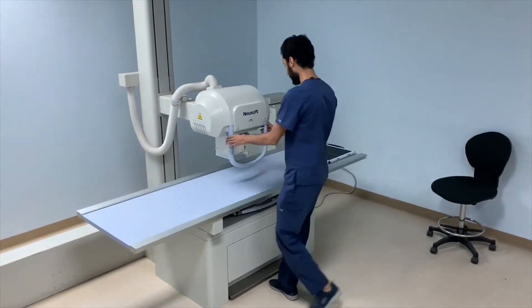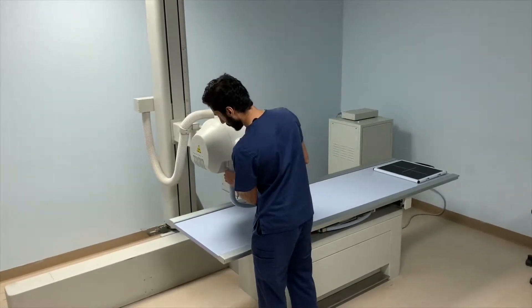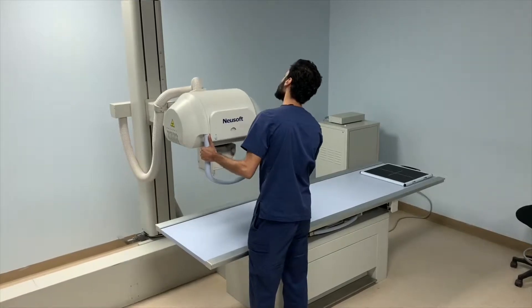Meanwhile, as the nurse is on his way, the technologist is setting up the room in order to take a proper image, starting with a wide horizontal movement of the x-ray tube until it's situated at the end of the table. Moving on to the SID — Source to Image Receptor Distance — by elevating it to a recommended height of 1 meter.